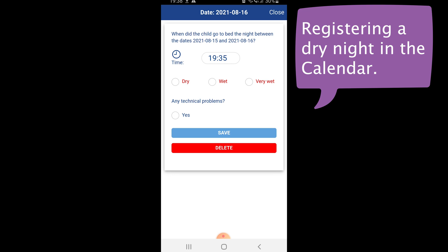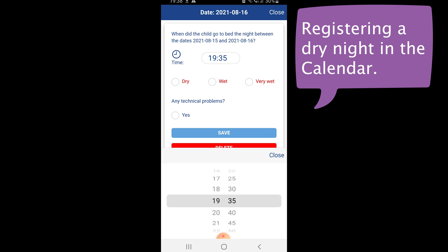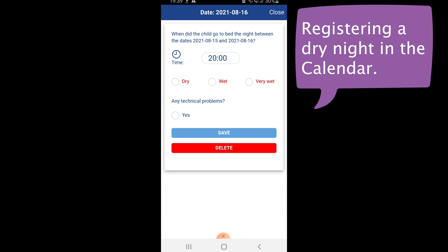First, enter the time when the child went to bed. Click on the time and enter the time when the child goes to bed — in this example, 8pm. Next, enter if the child wet the bed or not. Here we enter dry to indicate that the child did not wet the bed.